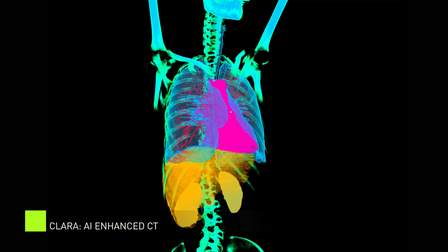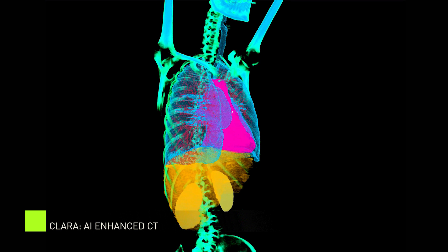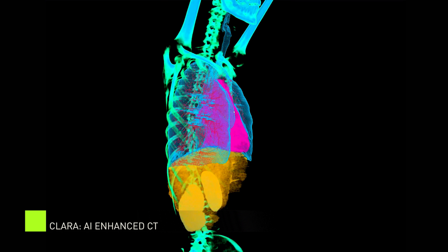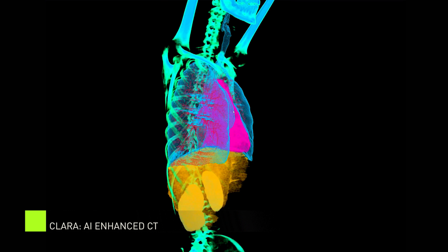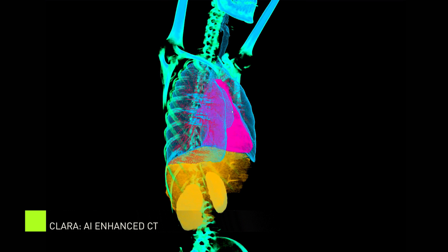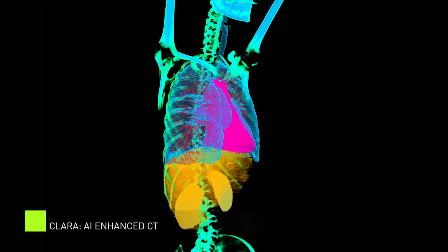Powered by NVIDIA GPUs, NVIDIA's Clara SDK enables efficient development and containerized deployment of deep learning models to propel medical imaging into the future.